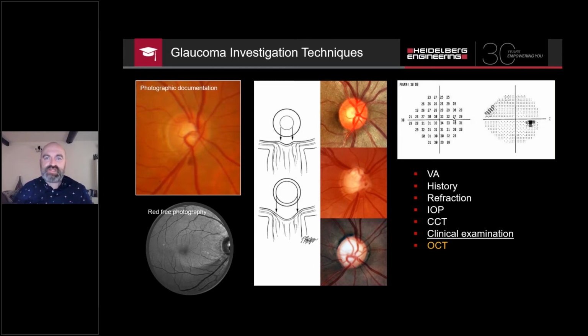And I've underlined clinical examination there, because this is an absolute must for any sort of retinal evaluation, but also crucially with glaucoma, to do that manual clinical evaluation to look into the eye. And OCT really is a complementary investigation to all these other techniques, which is why we call glaucoma a multifactorial diagnosis. You can't normally just take one of these values and assume glaucoma. We need to use a multitude of these to build up the story.